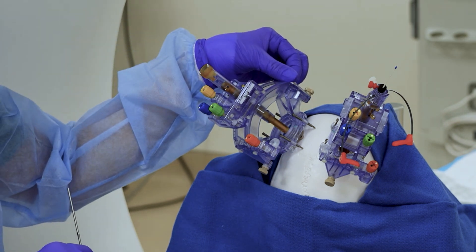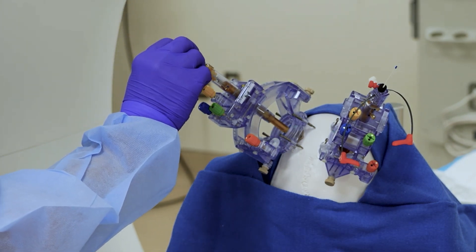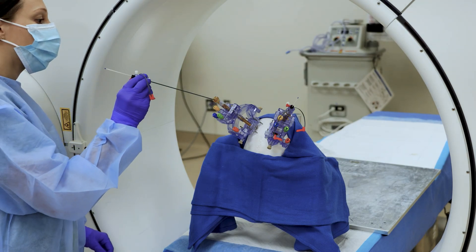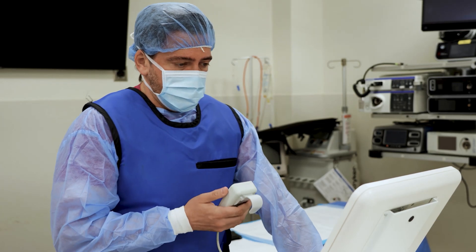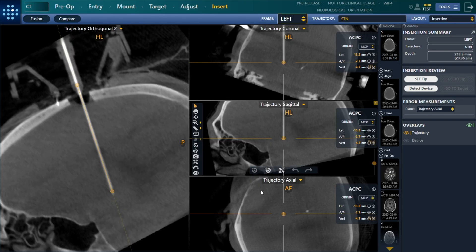In this example with the bilateral simultaneous option, the dura is pierced and the ceramic stylets are inserted on both sides within moments of each other. A post-insertion scan is acquired and sent to the ClearPoint workstation for comparison to the plan.